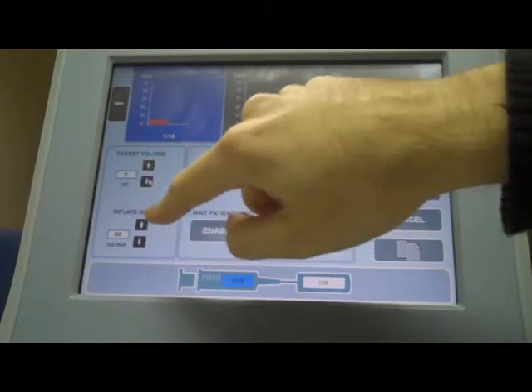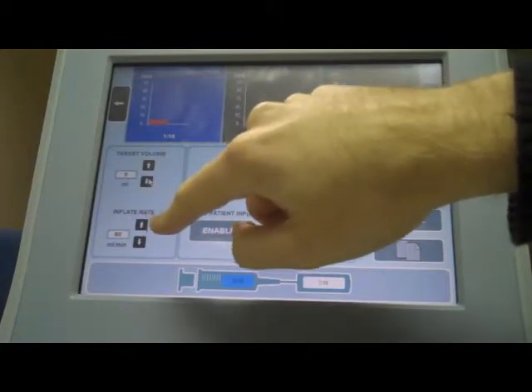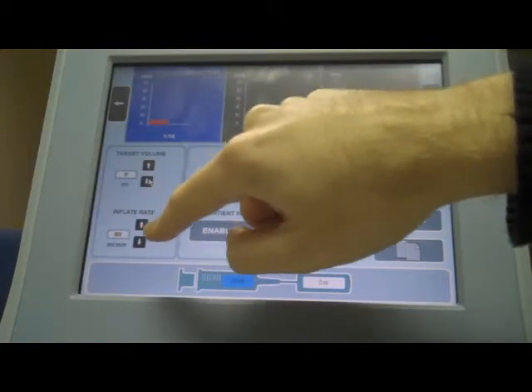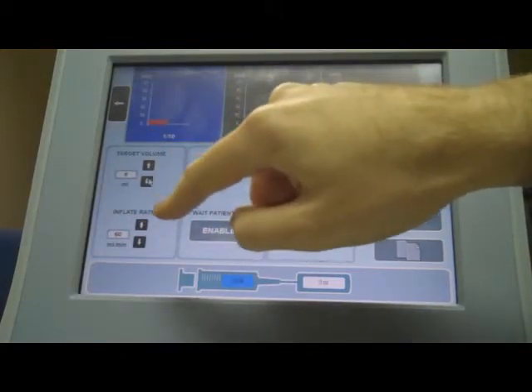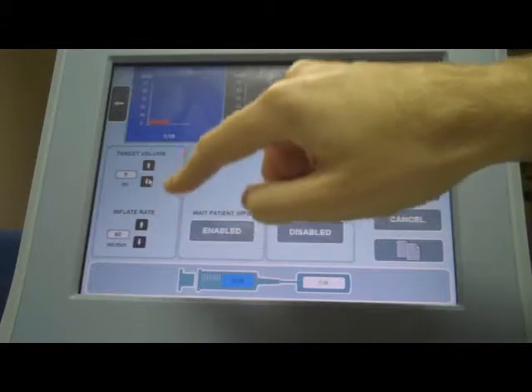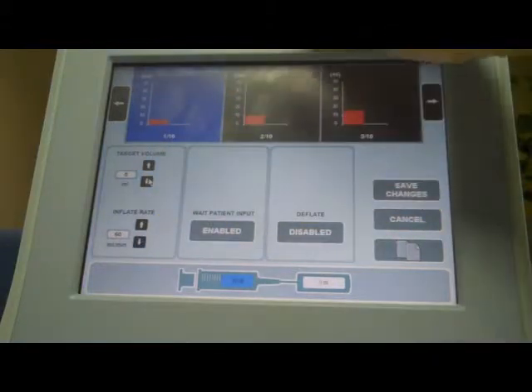Then you've got an option for the rate. You can inflate at a rate of 20 mL a minute, 40 mL a minute, or 60 mL a minute.